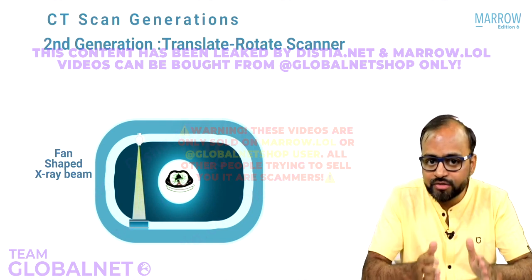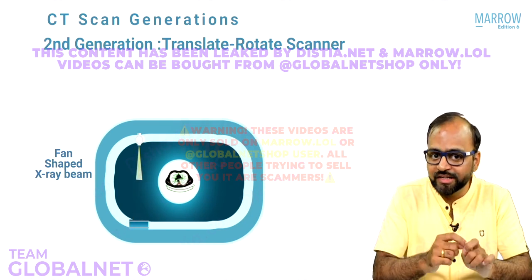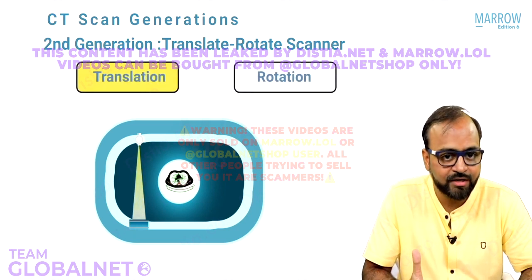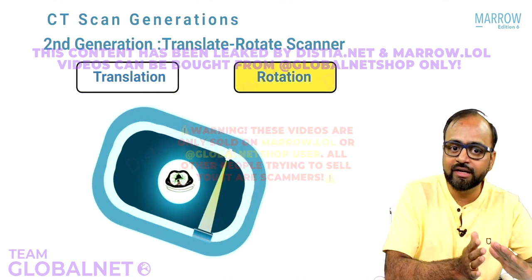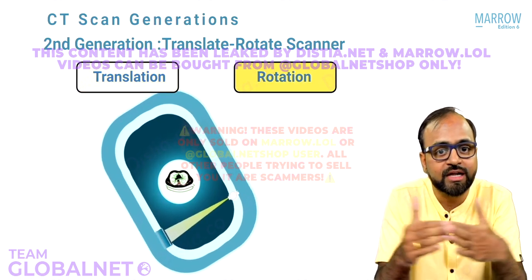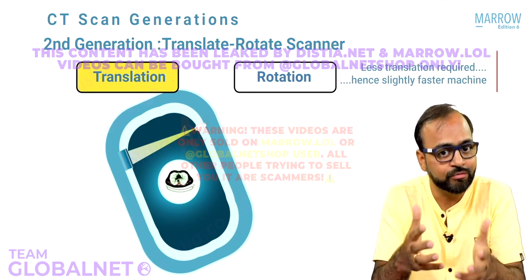And to collect the information from the fan shaped X-ray beam, instead of a single detector, there is a single row of detectors which is used. Otherwise, the functioning is exactly similar. It has to translate from one side to the other, then rotate, then again translate, then again rotate. But because it is a fan-shaped X-ray beam, the degree of translation which is required is less. So this is a slightly faster working machine.